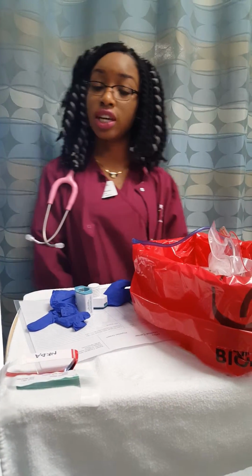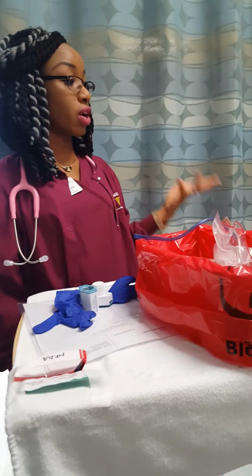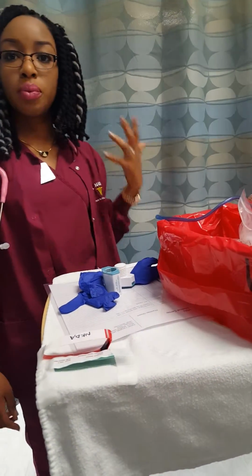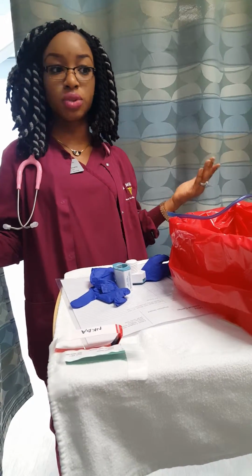But before I do that, I'm going to make sure I check the medication against my MAR twice, against the doctor's order and also against the MAR to make sure it's the right medication. I'm also going to check any contraindications, side effects or adverse reactions the patient might have with it. Also check the patient's medication history, just to make sure there is nothing that's going to contraindicate with it.